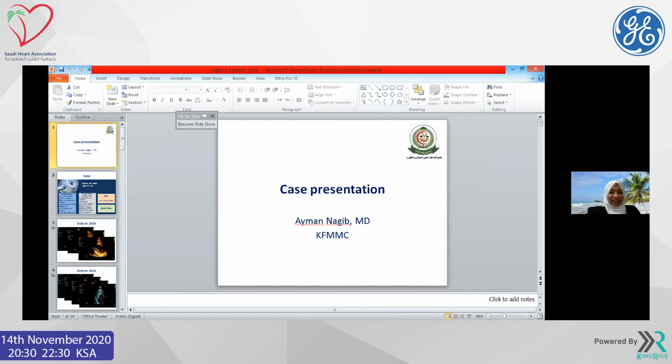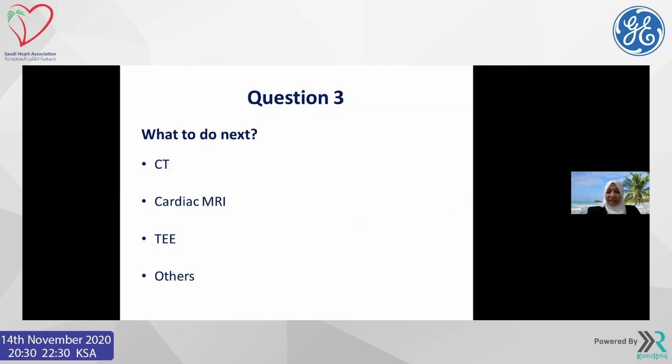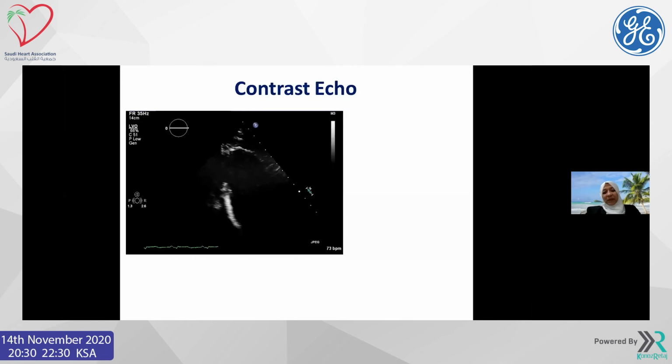Let's go with the contrast. I think the surgeon will not agree to take him based on the contrast. Exactly. You're obligated to do something more, but he will be very happy. I have to disagree. The surgeon maybe would ask for a coronary angiography to see if they will do CABG or not. But yes, I agree with you, Dr. Sami, and we did already coronary angiography, and we will present it.